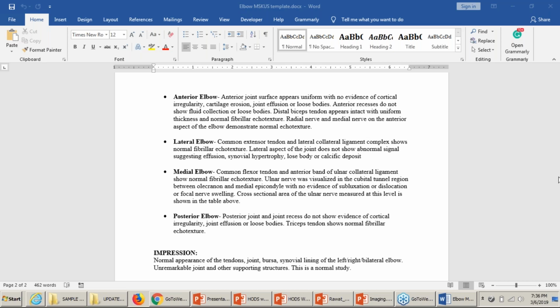All right. So I have divided the findings section, and I took the unremarkable and remarkable wording out because there was a lot of problem with Mac and PC format. So I think it's fine to not use that. Again, this can be changed based on what type of patient you're seeing. Maybe you don't need to do the distal biceps tendon in that patient.